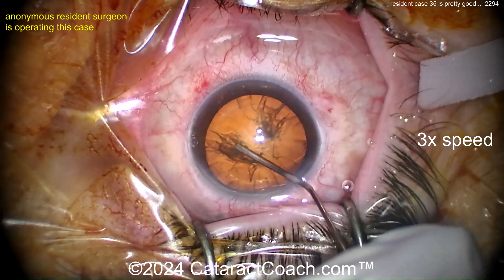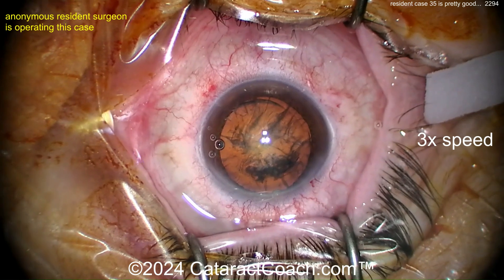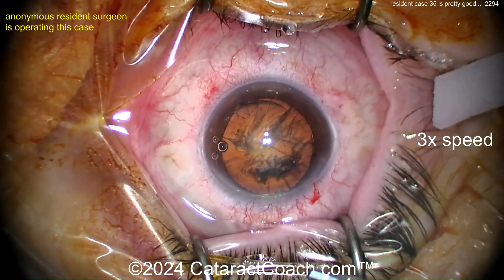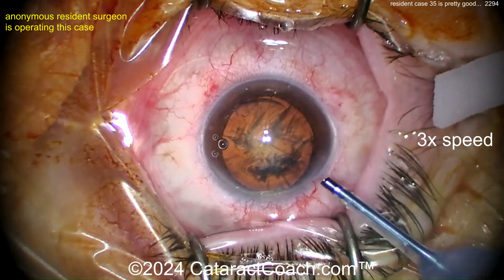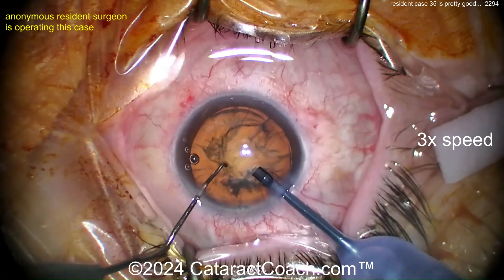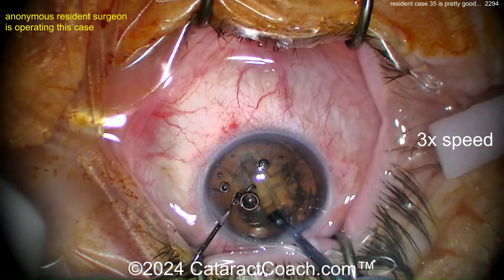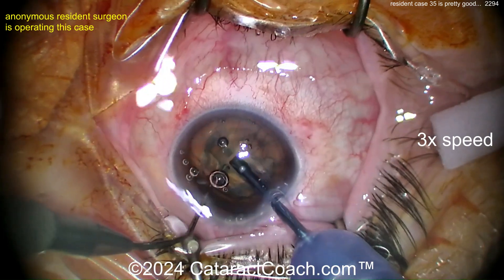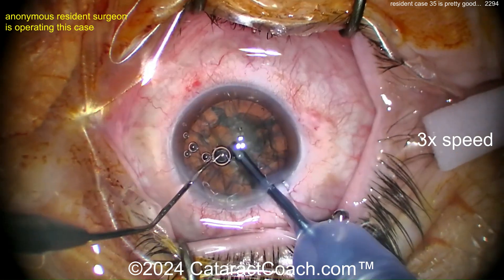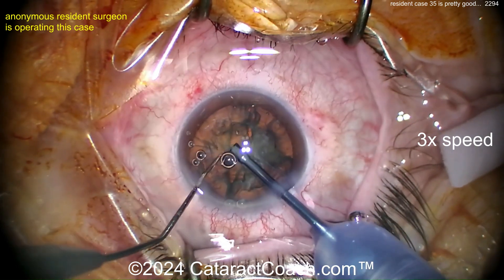Now more hydrodissection — get this thing rotated. You may also benefit from a little more magnification here. I think you probably want to operate with a little more magnification. Here comes the phaco probe. If you make the screen into a hashtag, only that center one-ninth of the screen is filled by the cornea limbus to limbus — so you're really not making use of your view. Now a groove down the middle — look how the eye is not in primary position during that groove. That's a good indication this is a new surgeon.